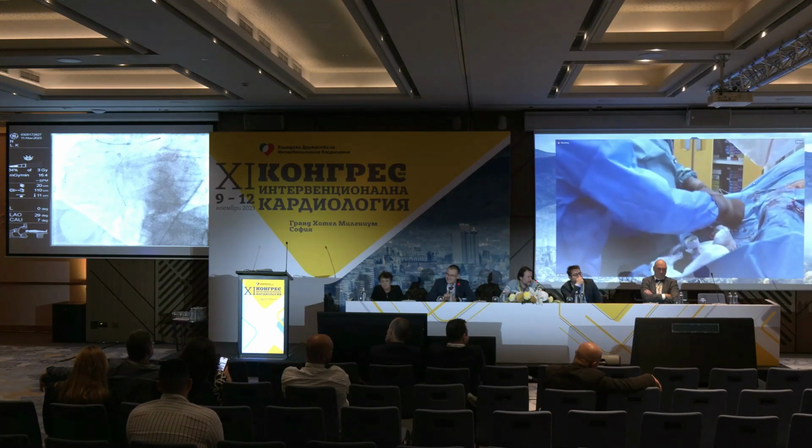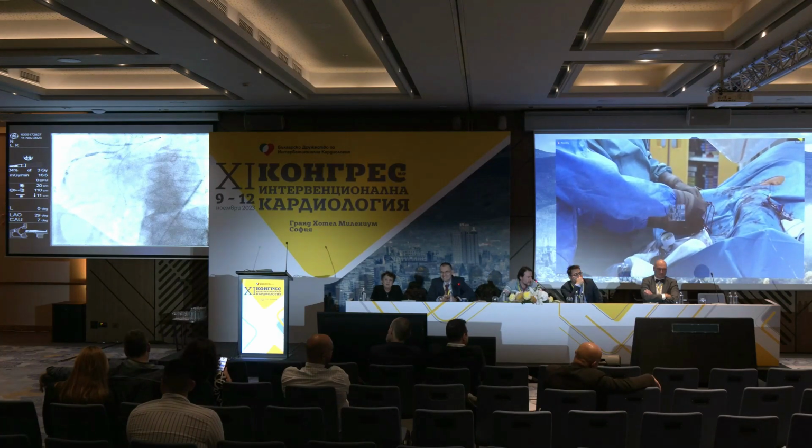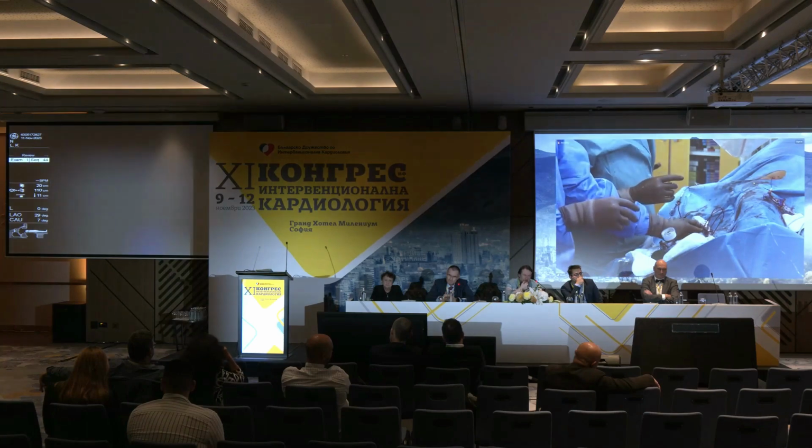From the right, always from the right. Give me a little bit, just give me a little bit of contrast. I will just go over there. So this time, let's play the previous to see what we are going to stent.